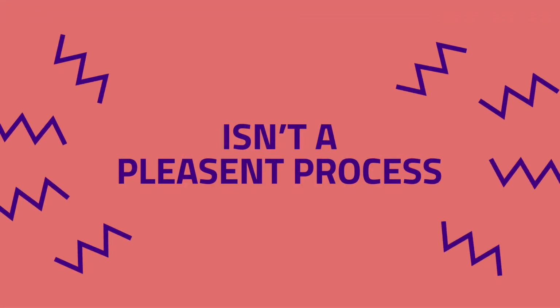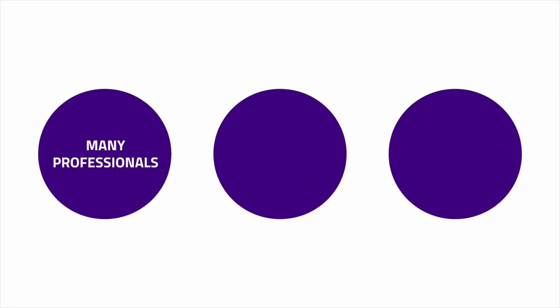This isn't a pleasant process, as the tube has to be inserted through a body cavity, and the patient normally has to be anaesthetized. Plus, it requires many professionals, proper facilities, and complex medical devices. And that means time and money.